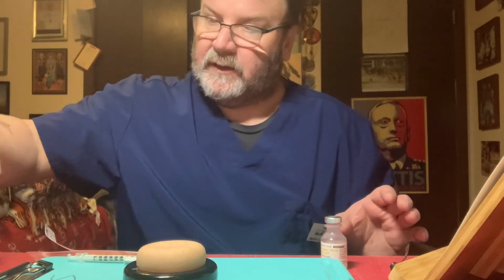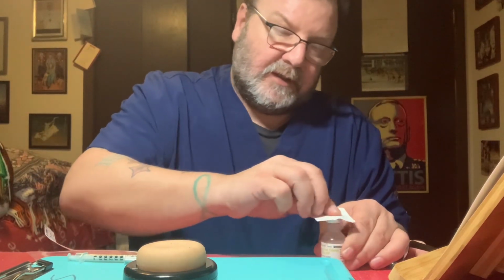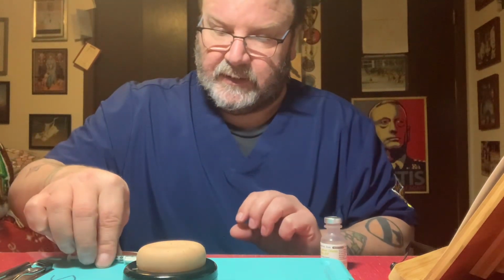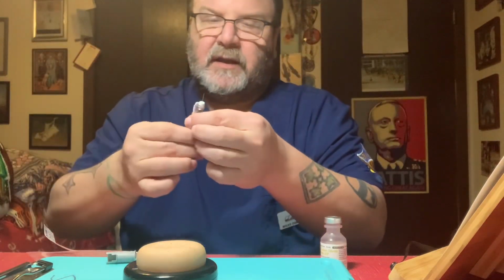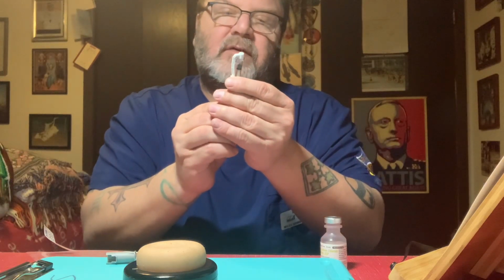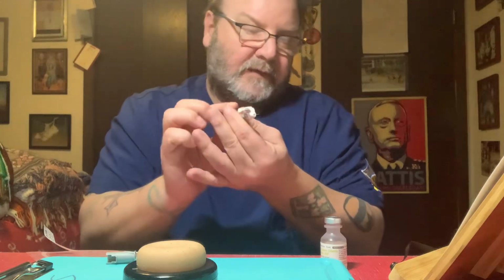Double OK method. For that, I'm going to take my antimicrobial swab, clean the cap, wait for that to dry. Now I will use the double OK method, and I will draw in 0.1 milliliters of air.